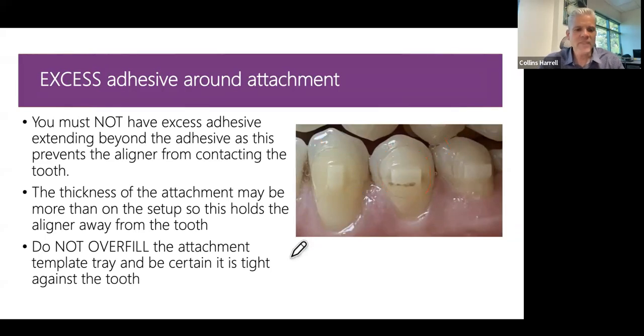Okay, so even though I do slightly overfill, I do it with flowable composite, and I do it in a way that thins it out, whisper thin, so it's barely there.